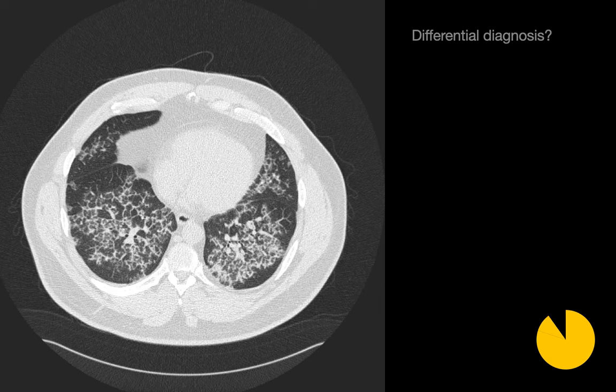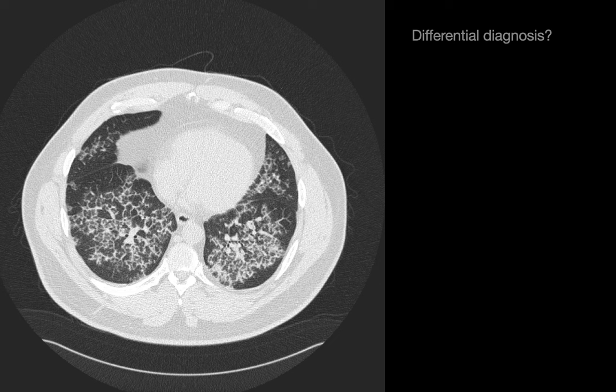What's your differential diagnosis? There are heterogeneous opacities in this patient's lungs in a multifocal bilateral distribution. Two imaging patterns are present: an interlobular septal pattern that predominates, and also some ground glass opacities. Since the interlobular septal pattern is the more dominant of the two, it's a good place to start from for constructing our differential diagnosis.